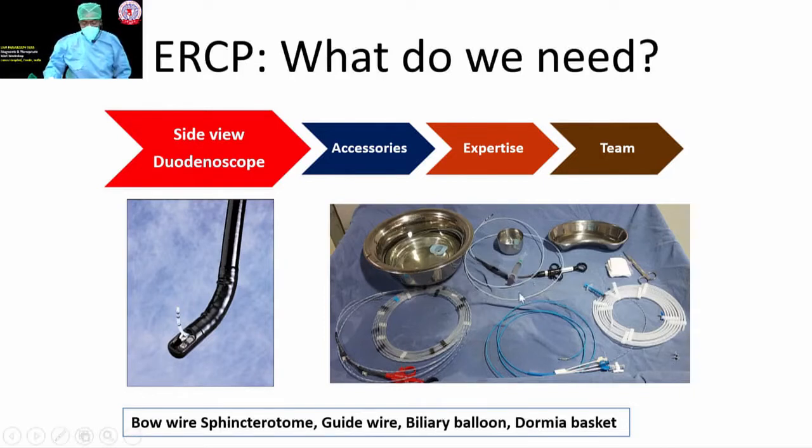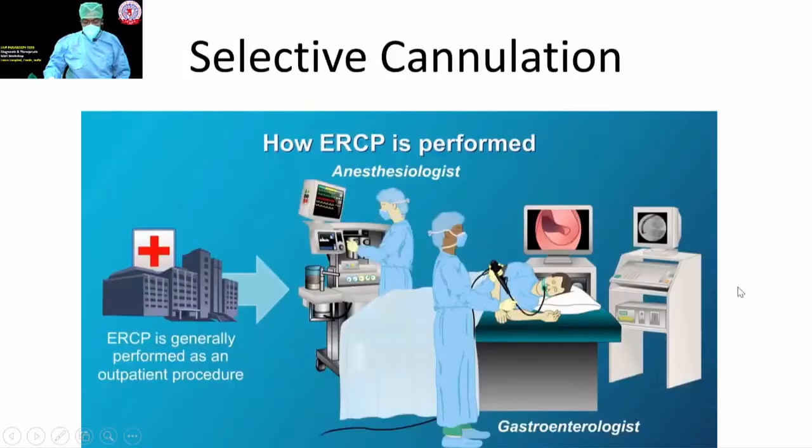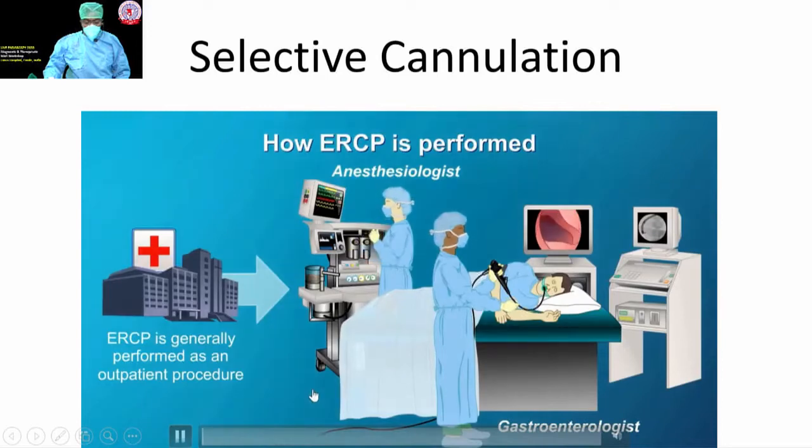If necessary, or if there is evidence of any sepsis, then we will probably put a stent in. Occasionally, there may be difficulty of cannulation. For that, we have a plan B, that is by using what we call a pre-cut sphincterotome. So those equipments are ready, and I will just show for a beginner, this is what the layout.